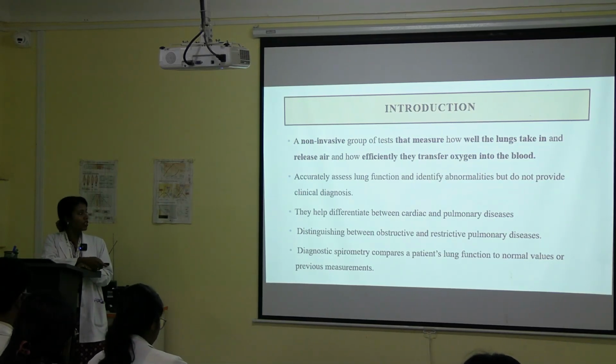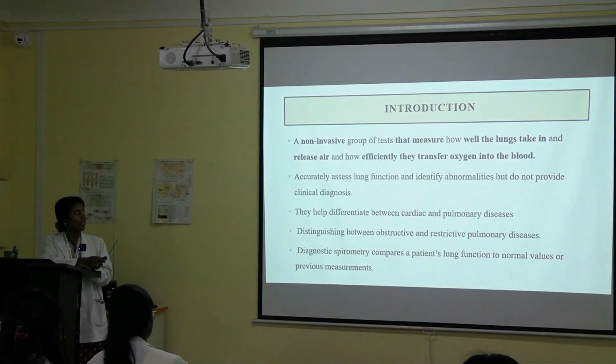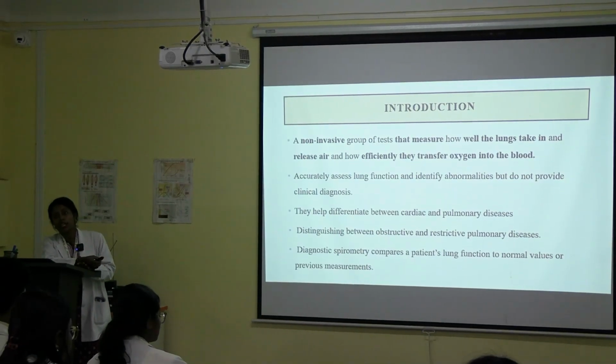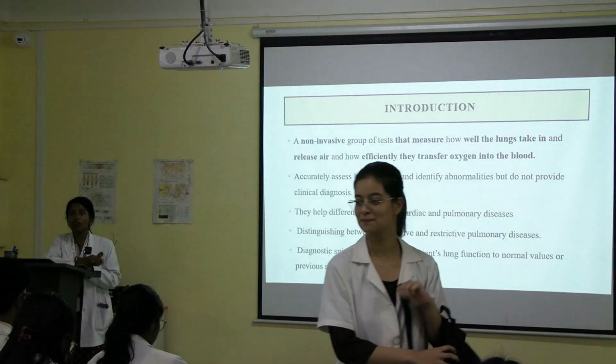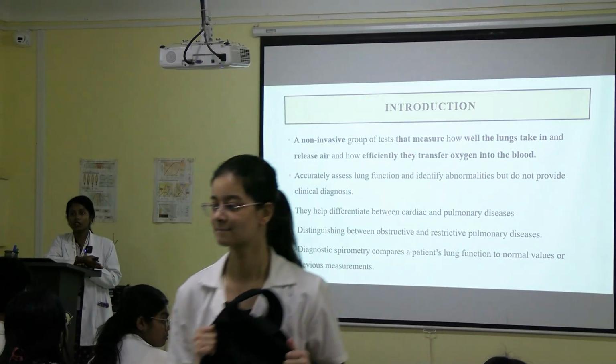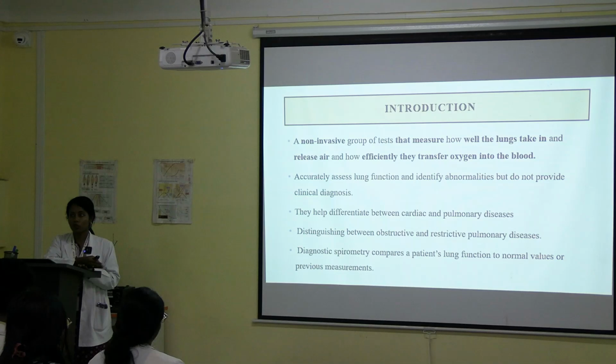Then they compare the patient's lung function to normal values and previous measurements. So they will be telling you how much the normal values are, and after taking the test we will compare: is it less? If it's less, then there might be some pathology.